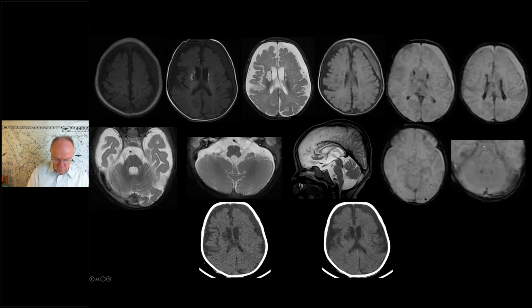There is some intraventricular hemorrhage in the bilateral ventricles, and some degree of volume loss in the supratentorial brain parenchyma. The posterior fossa structures demonstrate no signal abnormalities or volume changes. There is thinning of the corpus callosum and some microhemorrhagic foci in the left occipital region and also in the fourth ventricle. CT was done.